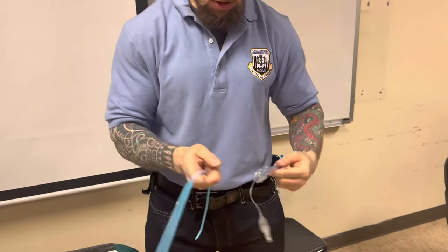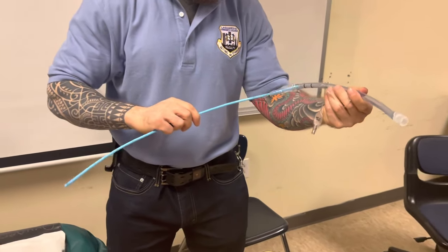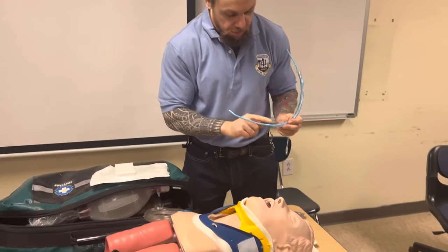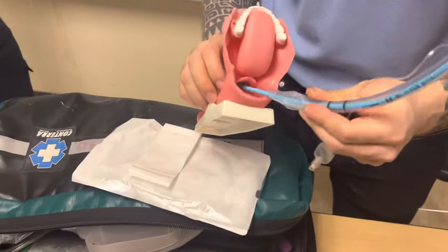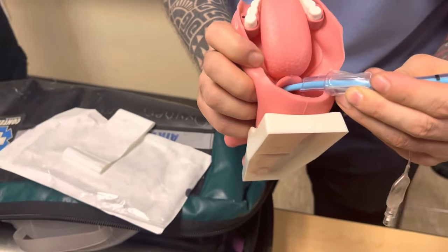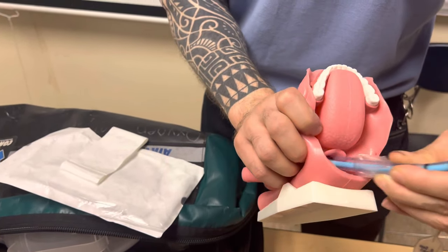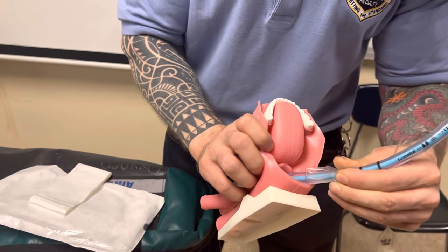Then we're going to railroad the ET tube over the bougie. You see how the bevel of the tube is pointed sideways? The tendency is for this bevel to get caught when I'm putting it in. So if the bevel gets caught, you're going to rotate the tube - bevel goes up - and then you'll be able to advance. If you're feeling resistance and it's not going through, pull back, rotate, and then it's going to advance forward. This is what usually happens.